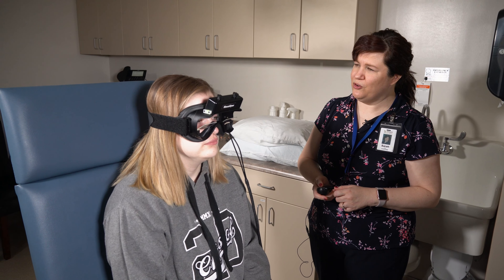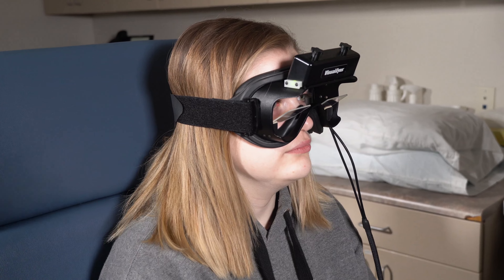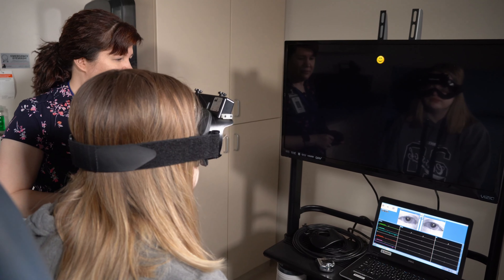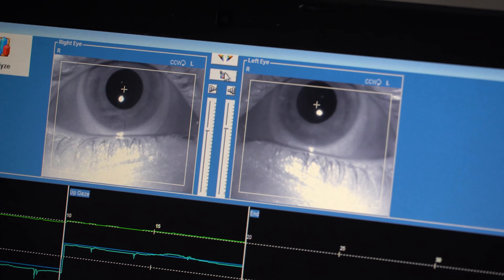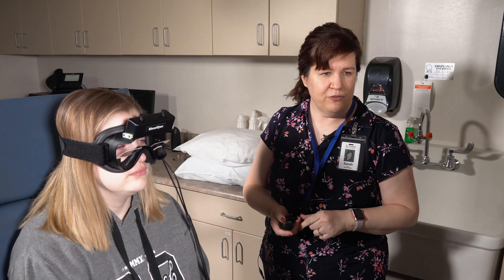We're going to be testing some parts of your brain that have to do with balance and dizziness, and we test this with eye movement. I want you to follow this target with your eyes — don't move your head. This is going to swing from side to side like a pendulum; hold your head still and follow with your eyes.